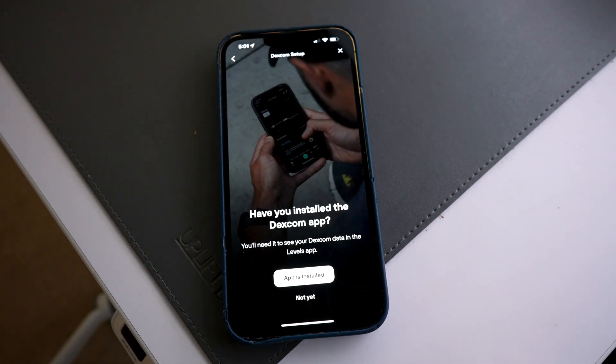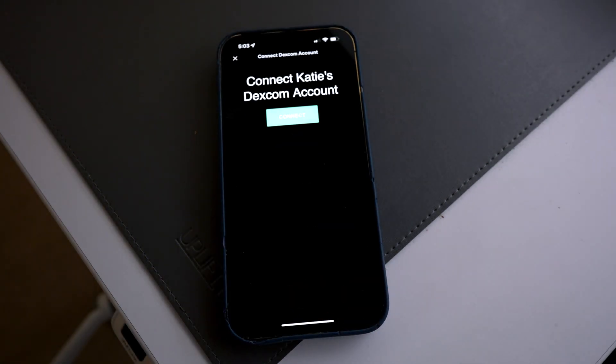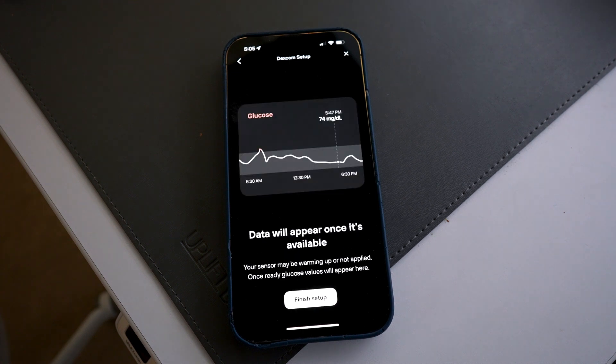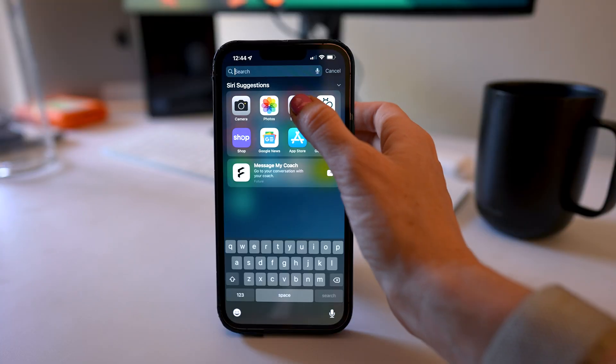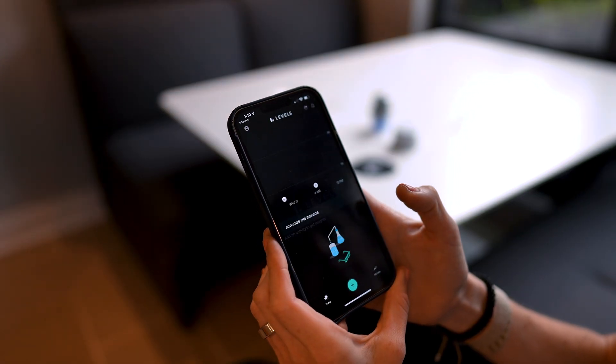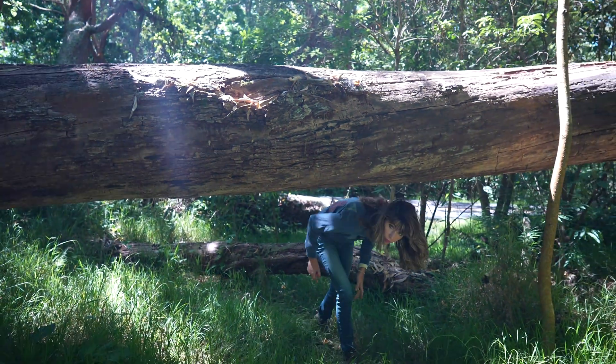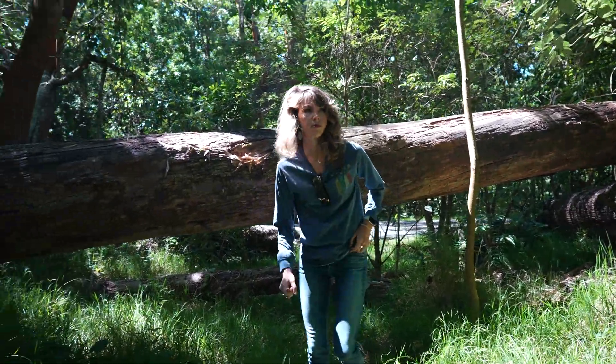But assuming that you did everything right, the last part of the setup is of course the phone connection. For this, you're going to need to install two apps: the Levels app, if you don't already have it installed, and of course the Dexcom G6. Then you're going to want them to talk to each other to sync the data. One important thing to mention: you must have Bluetooth turned on for your phone in order to receive the data from your CGM to the Levels app. The transmitter runs on a Bluetooth connection.